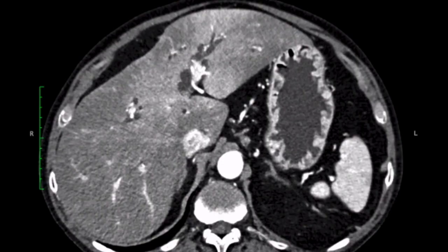Welcome to these additional video tutorials on staging pancreatic cancer. Let's start off with an easy case first to show you how the checklist works.